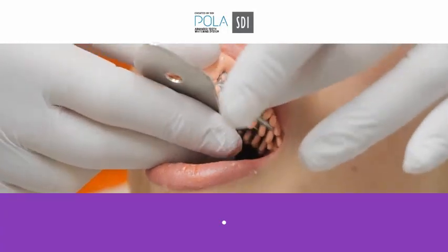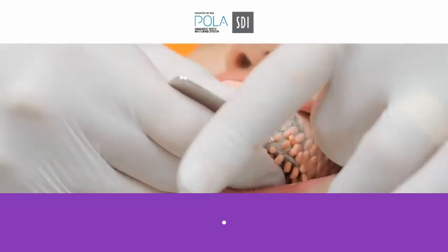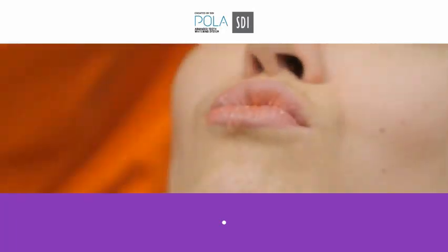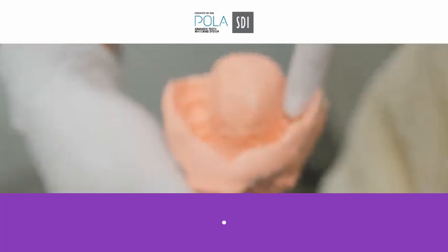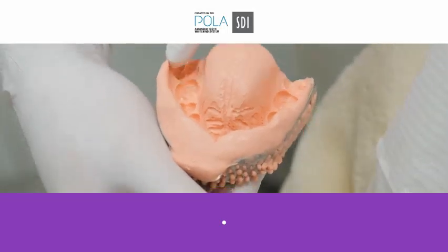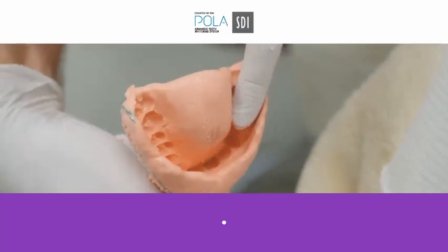It's funny, when you're teaching students, it's actually what your impression's there for. So you're not often looking for the perfect impression, so you don't need that. What you're actually trying to do is get from probably the premolars forward. Often I'll even cut off these, so all of it goes around. So you can see you've got a good seal around all the teeth. And it's all done. Super.